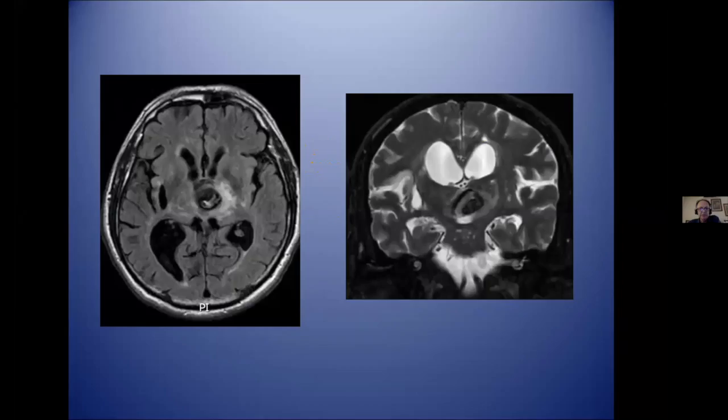and the MR, magnetic resonance, you see a partial thrombus aneurysm with peripheral hypersignal of the aneurysm, is gliosis or demyelinization.